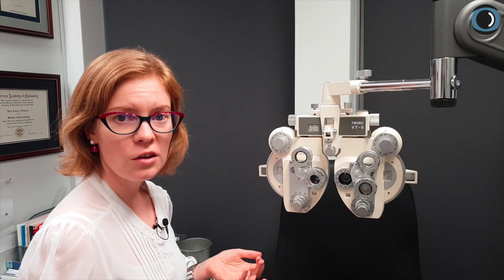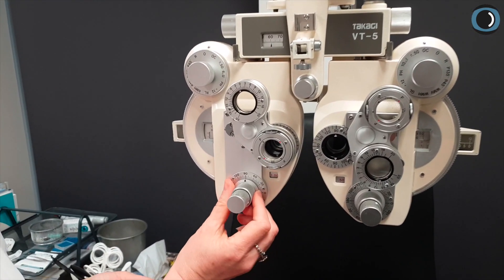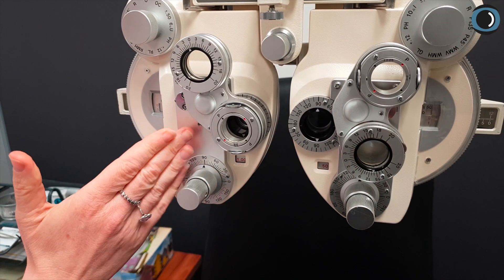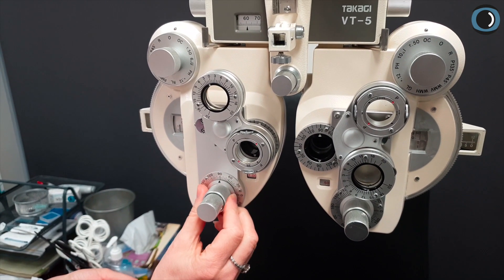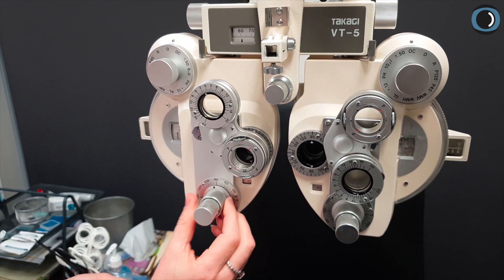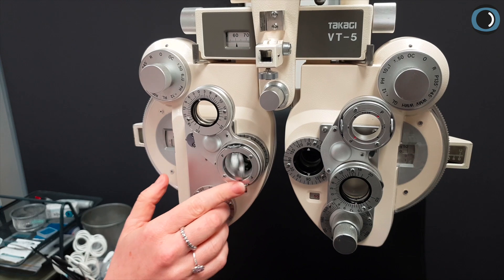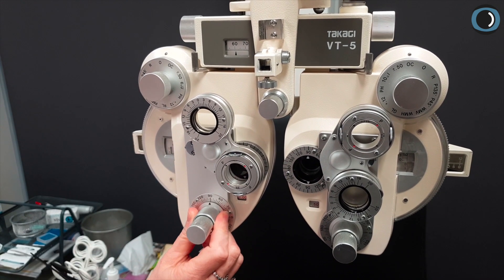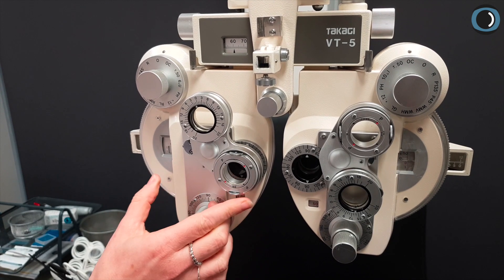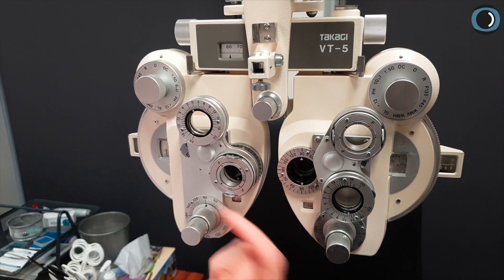Now we're going to look at the patient's cylinder axis. Again we want to give them a difference to see. Assuming the answer is cylinder axis 90, let's offset it by five or so degrees and see which they prefer — one or two. If the answer is 90, they're going to prefer one; they want to go this way. So let's do a little bracket on the other side. Which do you prefer, one or two? If the answer is 90, they'll want to come back this way.